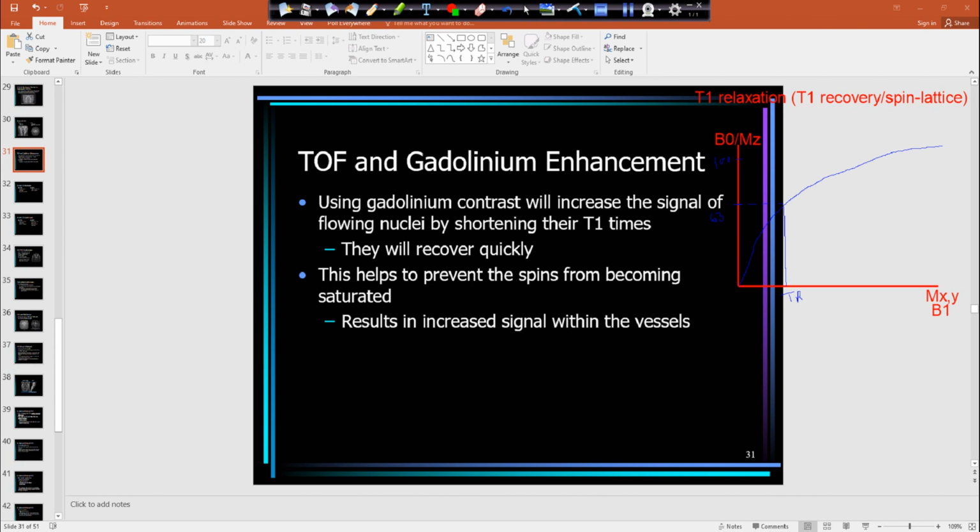All right, so what happens with this gadolinium once it's injected into our bloodstream? Due to its 7 unpaired electrons, we are going to be coming into contact with our tissue lattice. And our tissue lattice is all those hydrogen spins within all the different tissues. Remember, the hydrogen spins are usually denoted as H positive, because it has 1 proton, but 0 what? What's in a nucleus? Neutrons. 1 proton, 0 neutrons, it gives it that net spin. It starts spinning on its axis. It does have 1 electron.